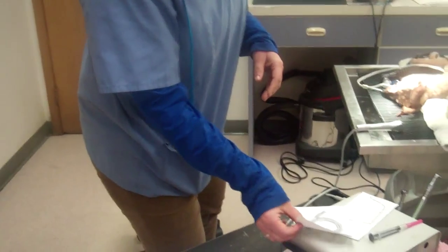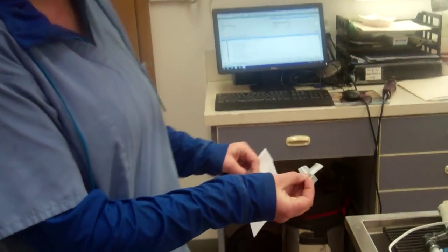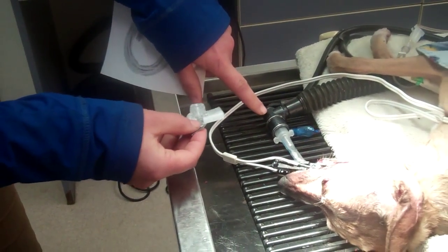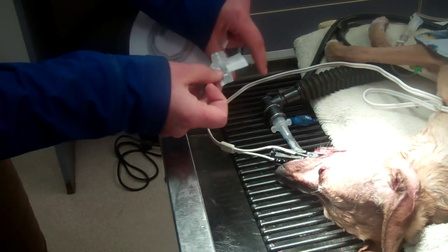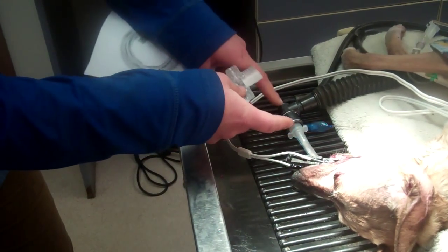Our clinic does not have a capnograph, but I'm going to demonstrate how you would use it and what the results mean. You would disconnect the endotracheal tube from the non-rebreathing system, insert this in between, and then reconnect them both.